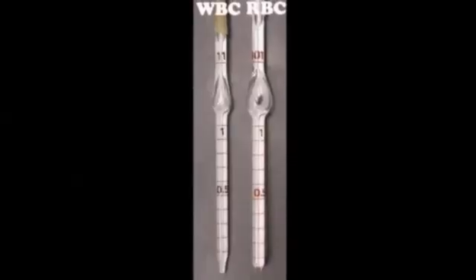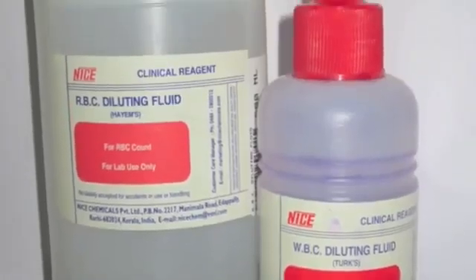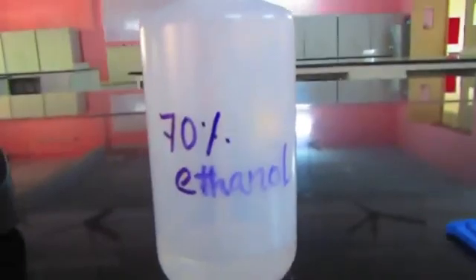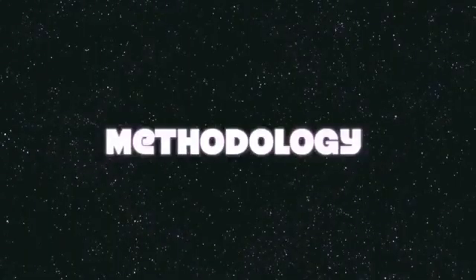Materials required. The materials required are hemocytometer, RBC and WBC pipette, RBC and WBC dilution fluid, pricker, 70% ethanol and a microscope.